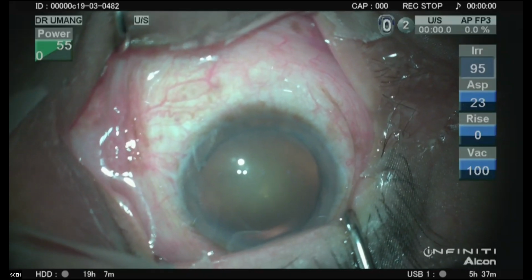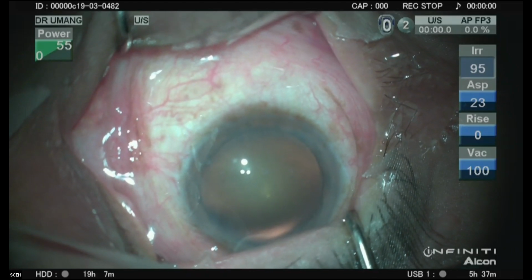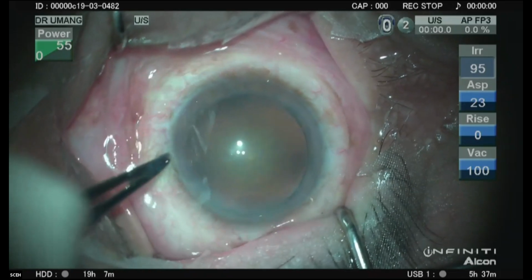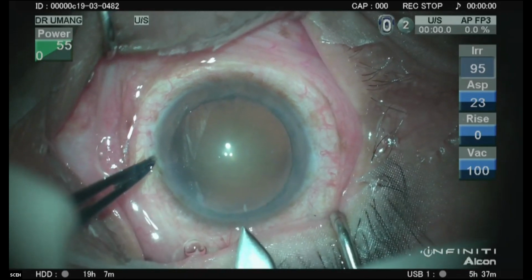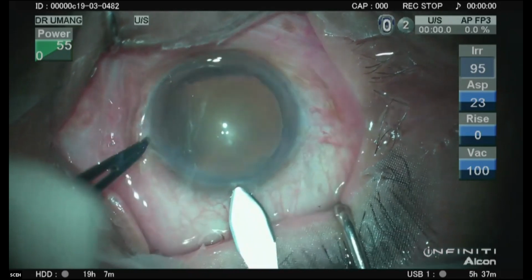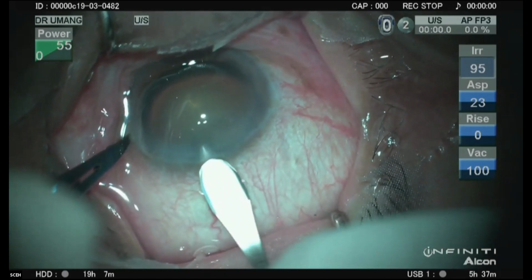We're going to be using a 2.75 blade, and one could make a limbal or clear corneal incision. I personally like the limbal incisions.